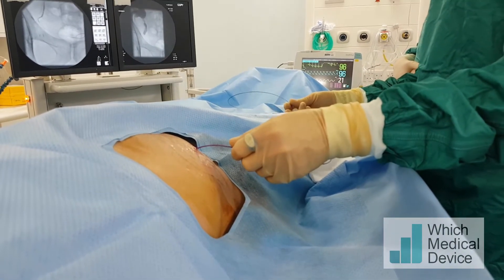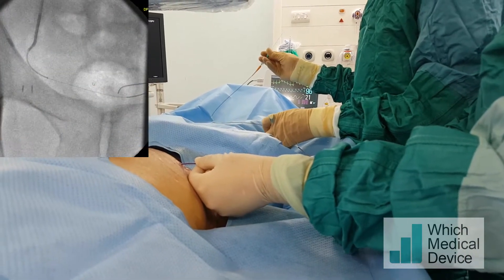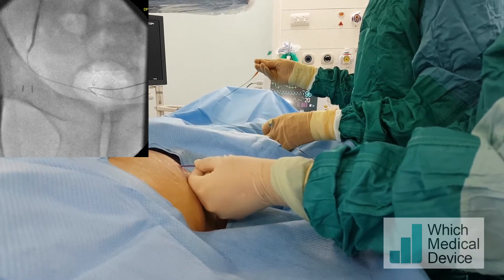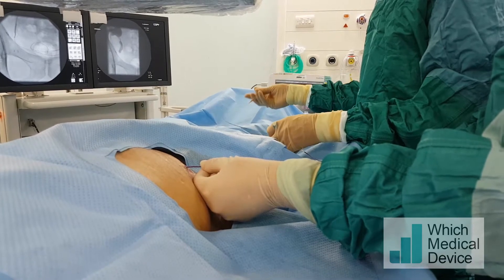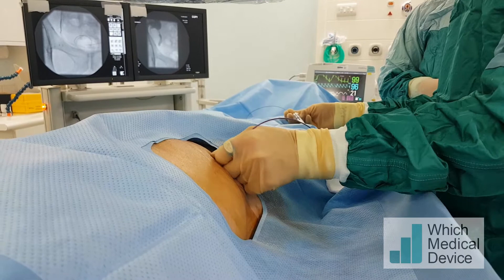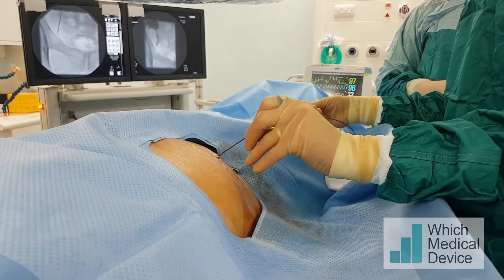Now with more support from the catheter, we're going to try and advance the micro catheter — and that's gone straight into the bladder, which is very helpful. We're going to put lots of catheter and wire in the bladder. Advancing the stent pusher through the stricture into the bladder is going to be very difficult because even with the support of this wire, this is quite a large catheter for that tight stricture, and I think it's looped up in the kidney at the moment.